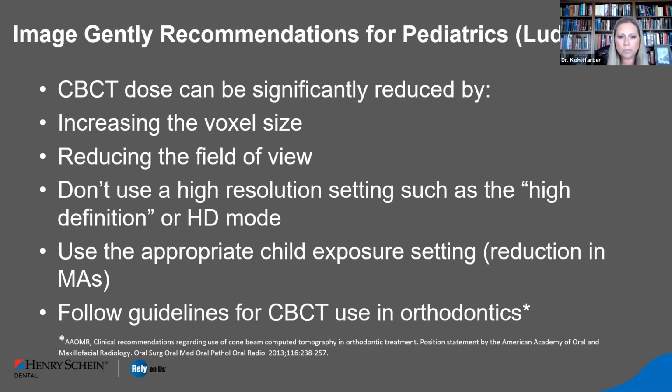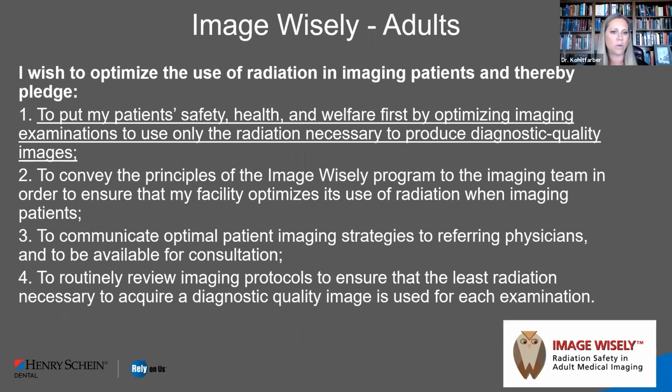Reduce the field of view. Don't use the high resolution settings, such as the high definition or HD mode. Use the appropriate child exposure setting and follow guidelines for CBCT use, such as in orthodontics. And we'll talk about that as well.